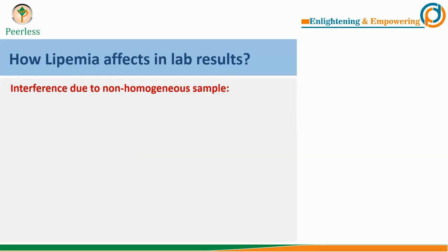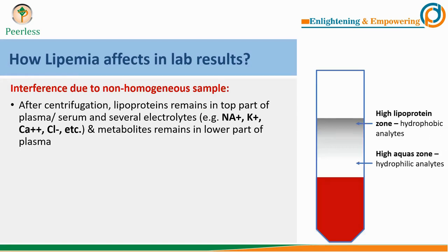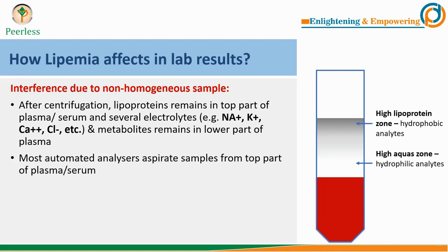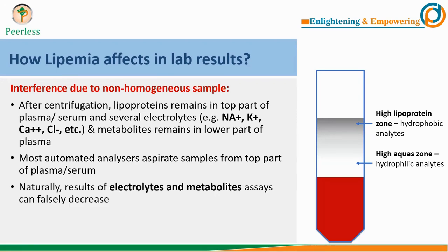Thirdly, if the sample is lipemic, serum and plasma become non-homogeneous. In that case, the lipoprotein part rises to the top of the serum and plasma, while electrolytes like sodium, potassium, calcium, and chloride, along with some metabolic analytes, settle in the lower part. Since automated analyzer probes aspirate serum and plasma from the top, the results of electrolytes and some metabolite assays can falsely decrease.